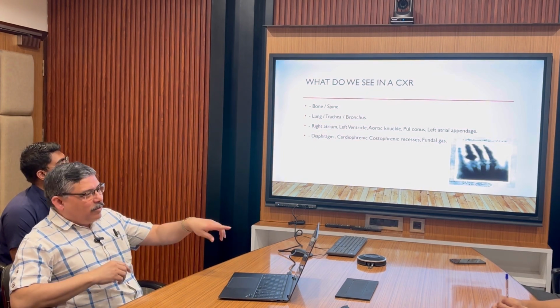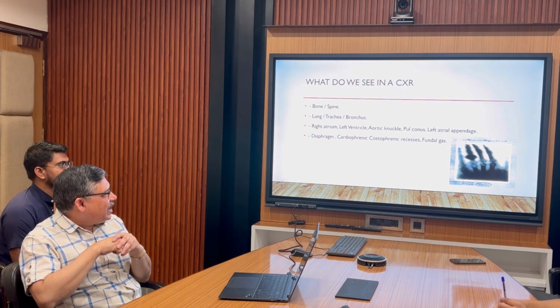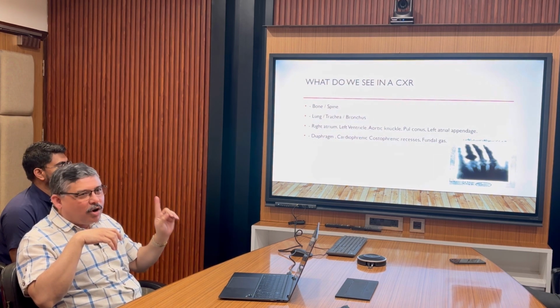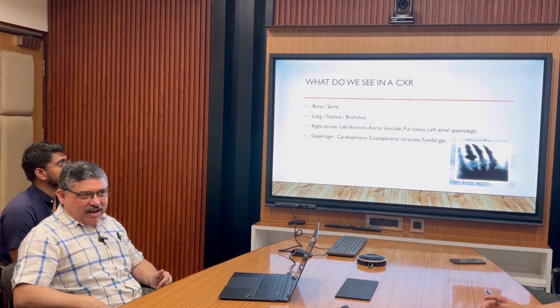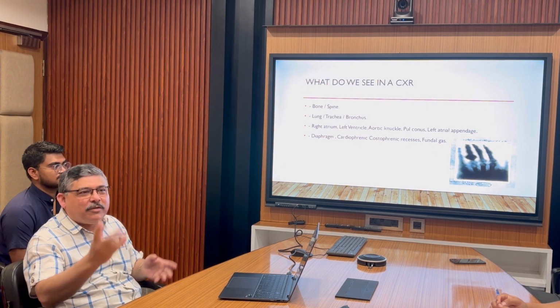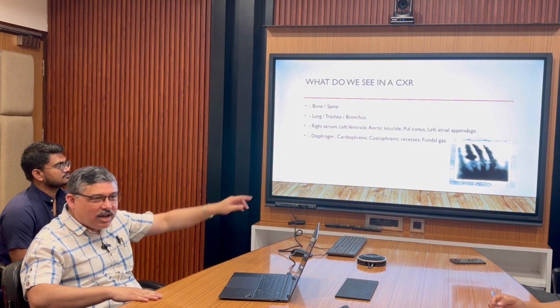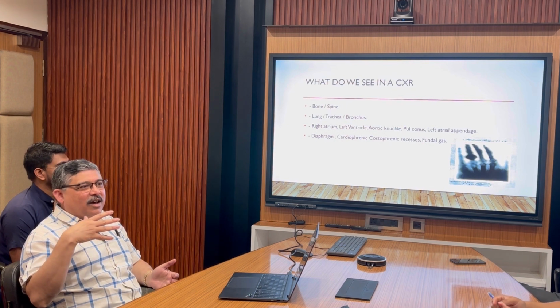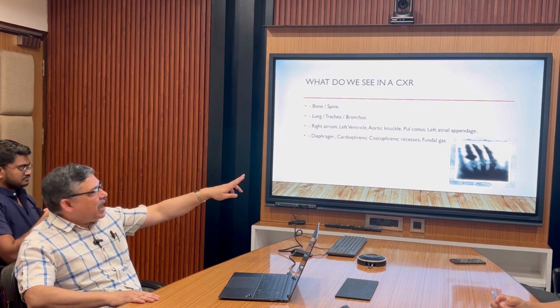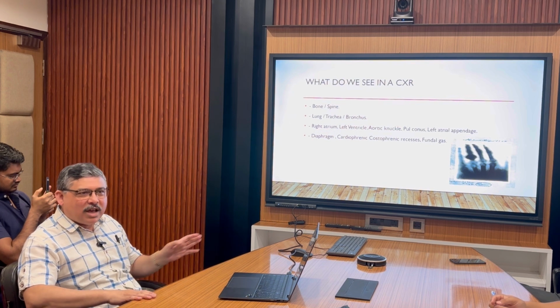What do we see really? Can you tell me what that is? This is the first X-ray that Röntgen took, of his wife's hand. And the comment that the wife gave was, "I could see my death." It is a famous quote from Röntgen's wife. She could see the bones, no? So that is why she said, "I could see my death in this picture." Röntgen's wife's X-ray hand, and there is a ring there. This is the first X-ray that was ever taken.